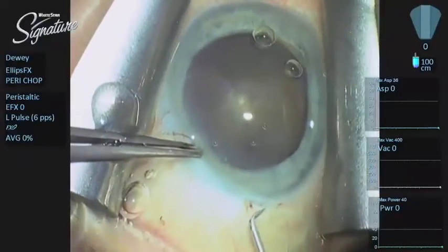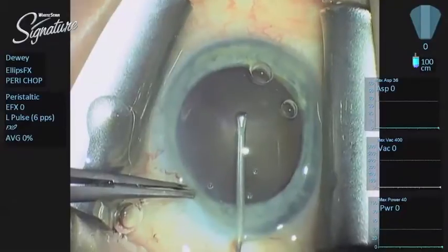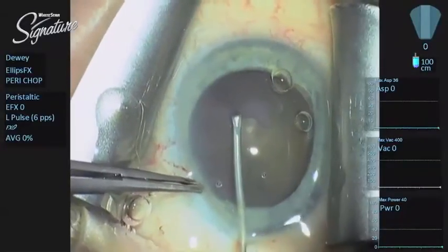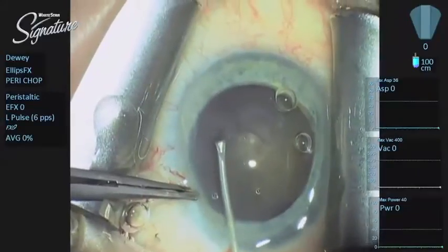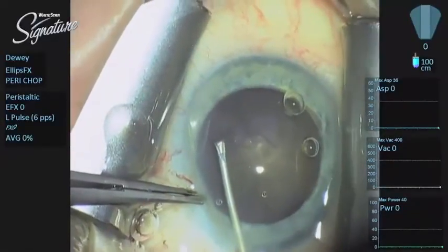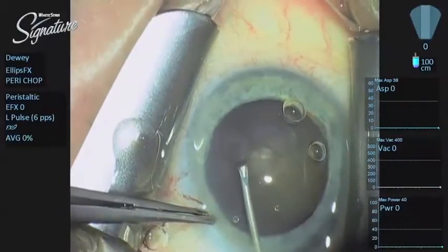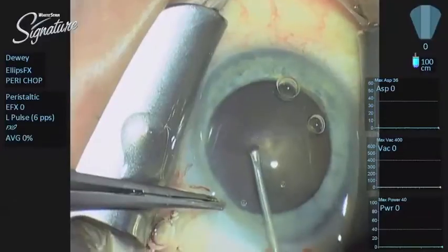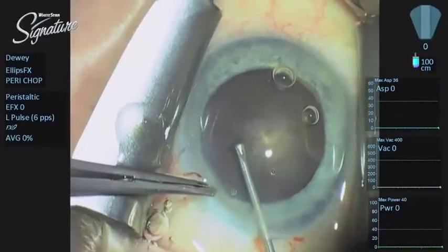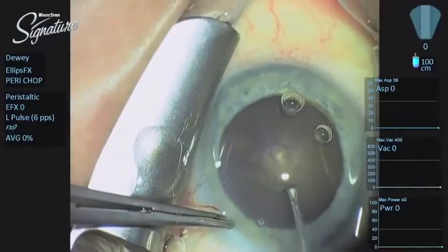Once inside the eye, we're going to go ahead and do a capsulotomy. A continuous tear capsulorhexis under these conditions can be challenging. If the case is extra dense as this one is and the red reflex is exceptionally poor, you will definitely want to consider trypan blue to help you stain. But there is just enough differentiation of the surface features here that I am able to perform the continuous tear capsulotomy without staining the anterior capsule.